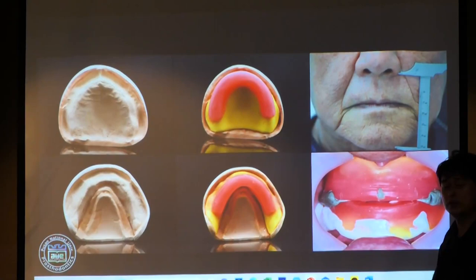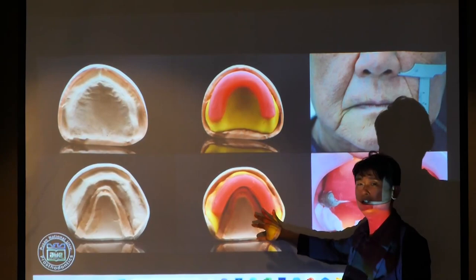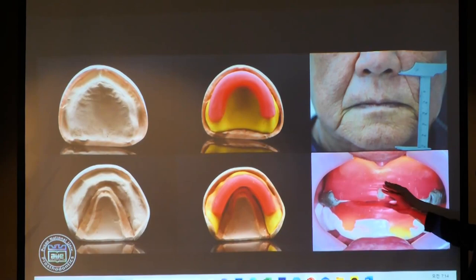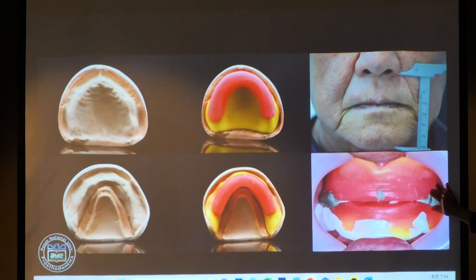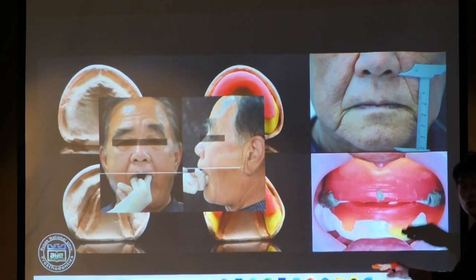No. I always adjust this occlusal wax rim after receiving it from the dental lab. Through adjusting the occlusal wax rim, we can get the vertical dimension, the centric relation, and the location of the anterior teeth, and then the bite material is engaged like this. So at that time, we have to measure the vertical dimension, and then adjust according to the occlusal plane like this. Did you do that?